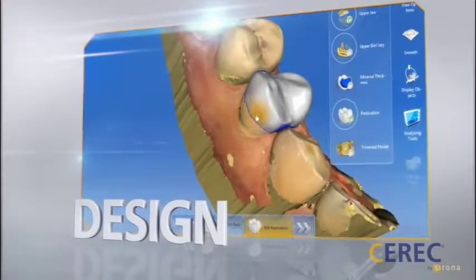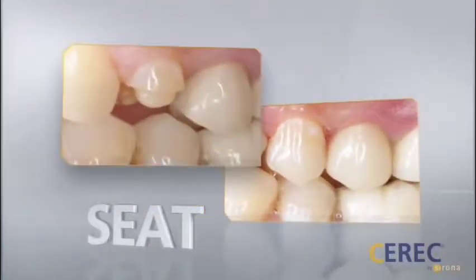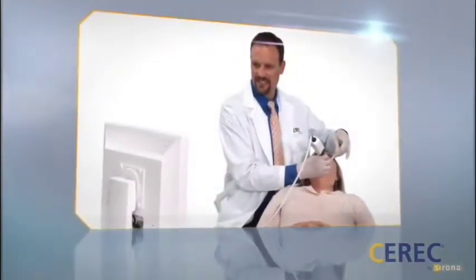We actually have to mill the restoration out, then we try it in, and then it goes into the oven where the material goes through its final hardening process, and then we put it in the mouth. So, there's 10 minutes here, maybe 25 minutes there, where the patient's kind of hanging out, reading a magazine or playing on their iPhone. Now, how long have you been working with this particular technology?